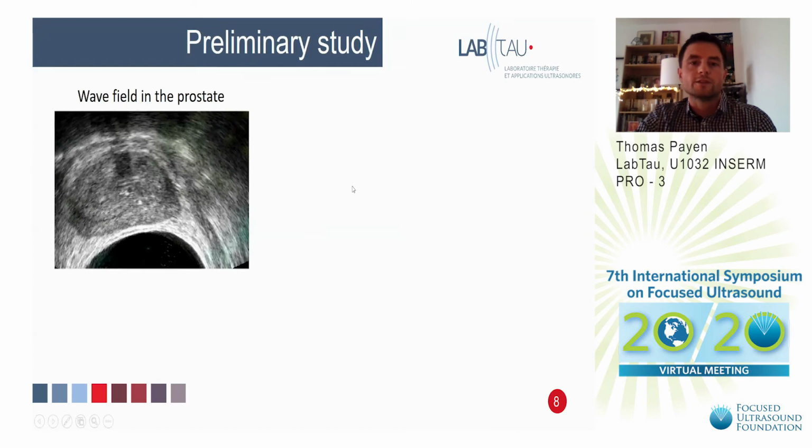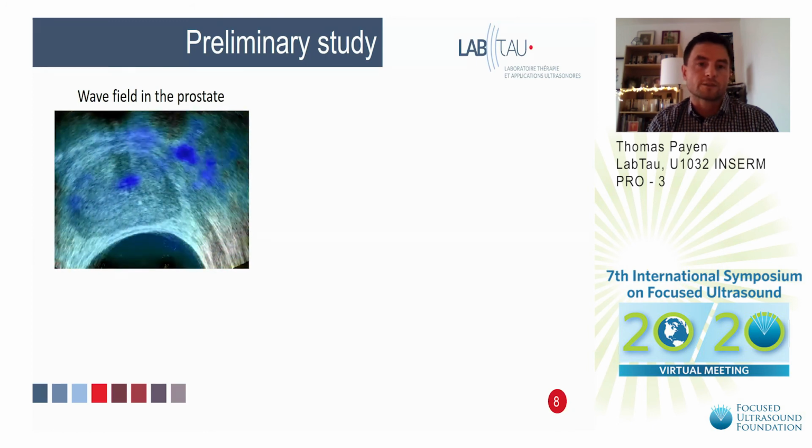In patients, we did a preliminary study. First, the question was, can we estimate the wave field in the prostate? As you can see, there is motion pretty much everywhere in the field of view, which is pretty reassuring for us, even though we can't see the wavefronts because it's an acquisition at 22 Hertz only.